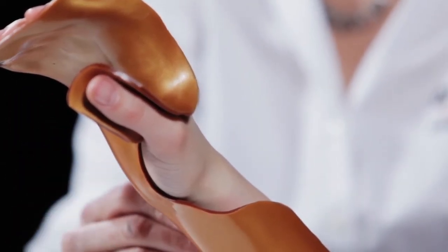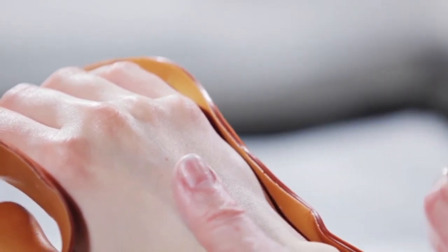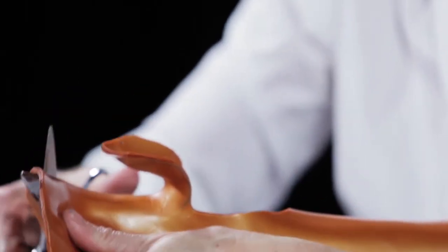Mark the trimming edges along the borders of the orthosis. This can be done both inside and outside the orthosis. Remove the orthosis from the patient and trim, leaving a nice smooth edge.